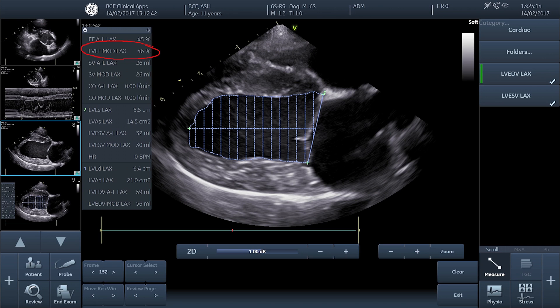The label 'Mod LAX' means modified Simpson's long axis view. The number above it is from the area length method — one of the other ways of calculating ejection fraction mentioned at the start of this video — but we're just concentrating on the 'mod' figure for now. As with all other measurements, remember that it's always sensible to repeat your measurements — generally three to five times is advisable — to make sure you're getting repeatable, sensible results each time.